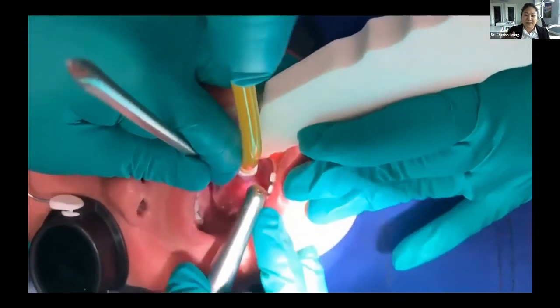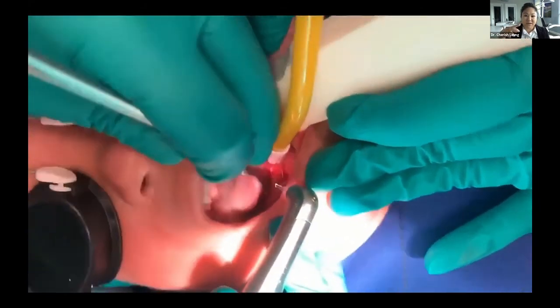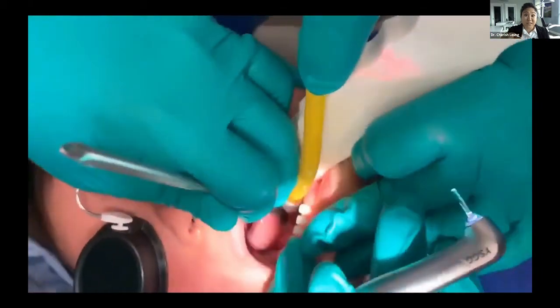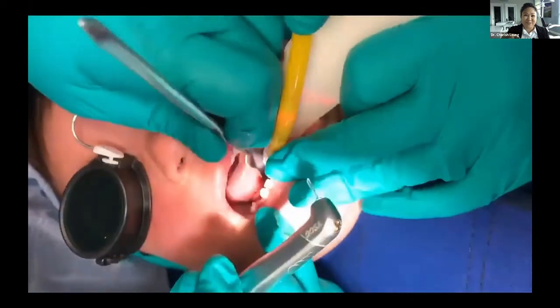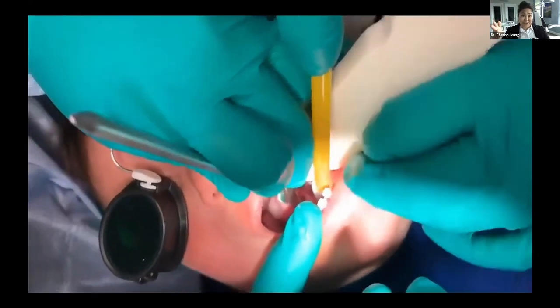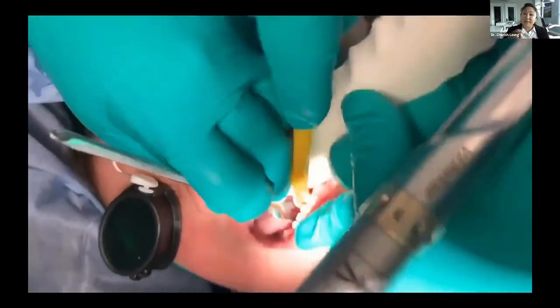So we had him propped, we had the suction going. Also toddlers can move their tongue around a lot. So he's running his tongue away, but it's fine. Basically, and he also bites really hard. So he's really getting through our foam stick. So this is where that other one would have come in really handy with the suction on it and the handle. But anyways, he did fine.